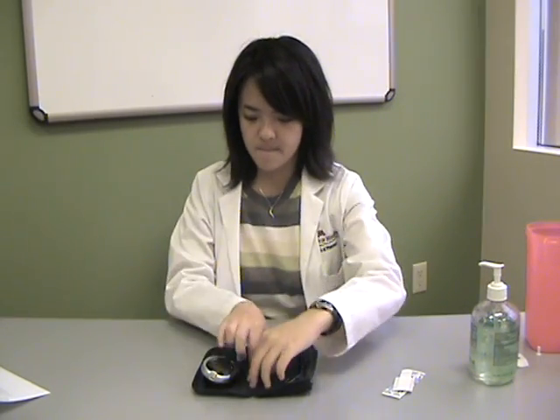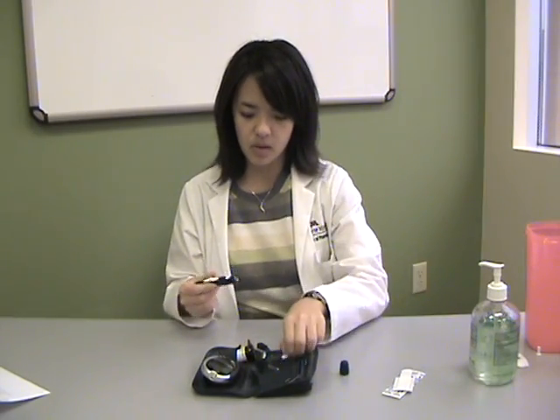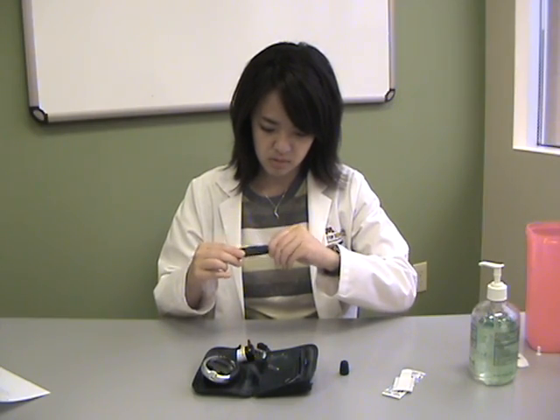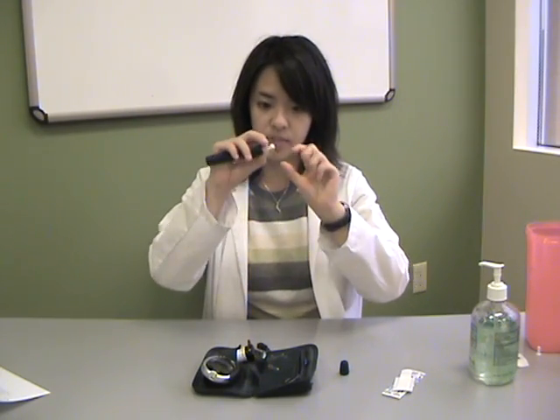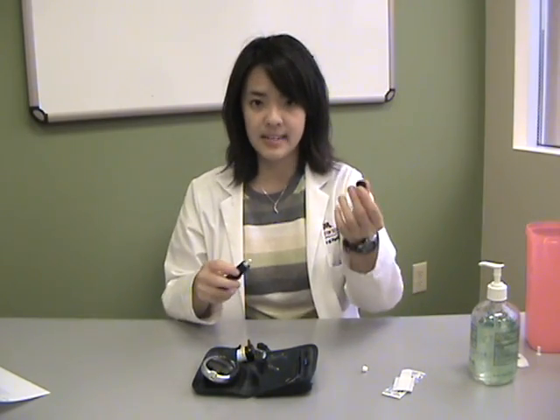Next, we will put together your lancet device. Take your lancet device and remove the cap. You will now put the lancet in and remove the cap by twisting it off. Next, replace the device cap.